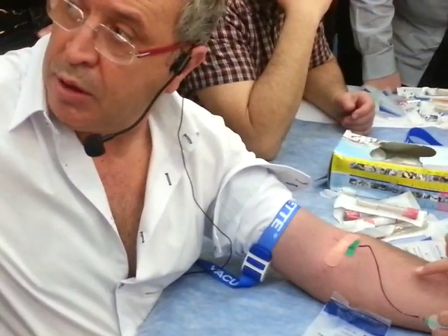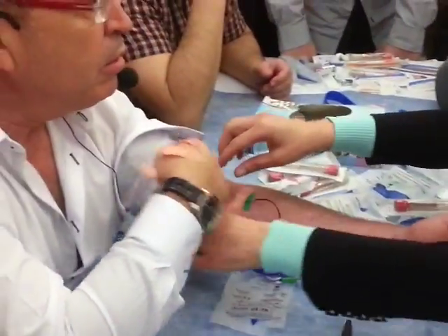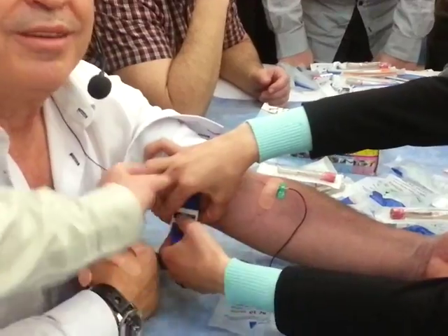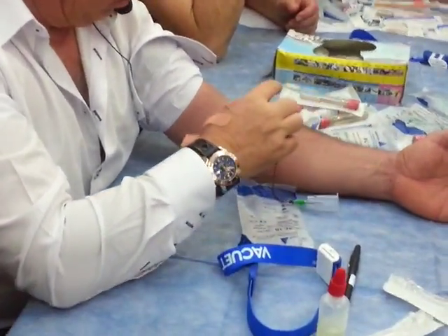Can you put these tubes in the machine? Yes. Okay, now what we have to do? To remove the lid? No. First... Okay? Then... actually, I should... sure. Okay?